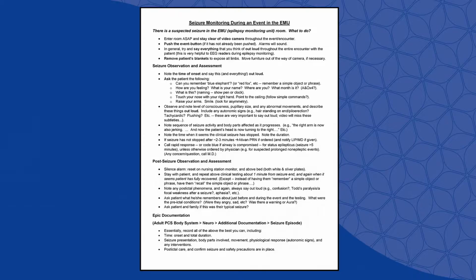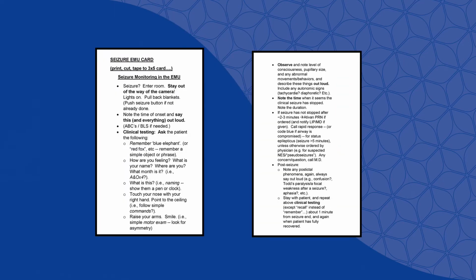This educational video, hopefully brief but to the point and useful for you, is what to do if you have a seizure in the epilepsy monitoring unit. We have instructional sheets that should be up on 8 North Nursing Station. You can always call neurologists or the EEG technologists to get these. We also have cards with everything I'm about to go over in the video that should again be up at the 8 North Nursing Station on what to do if you see a seizure.